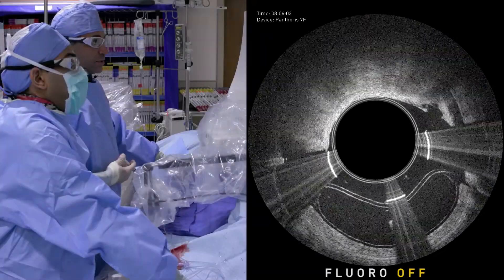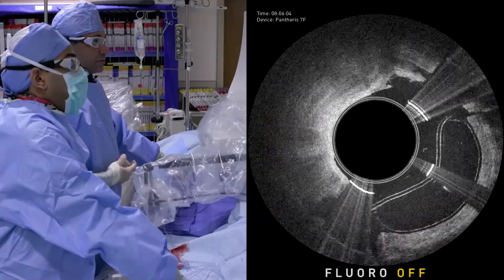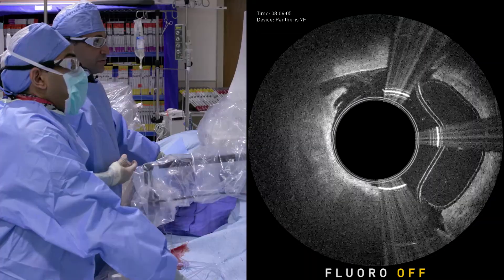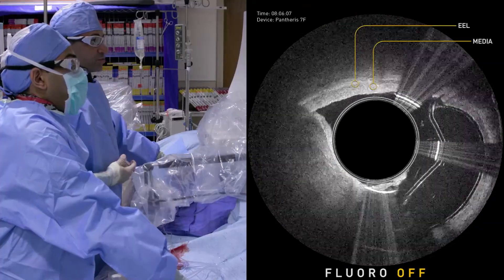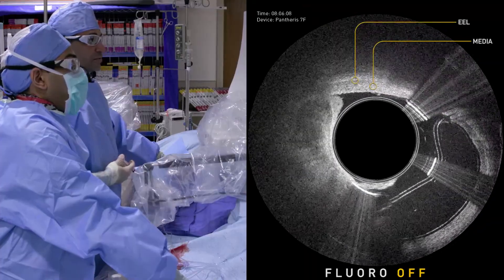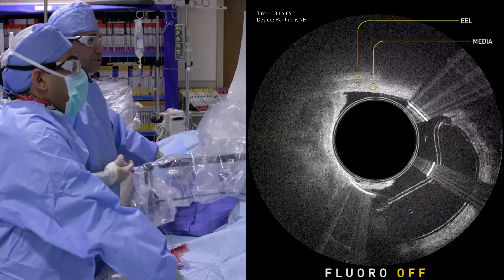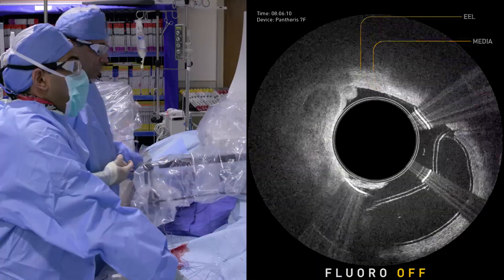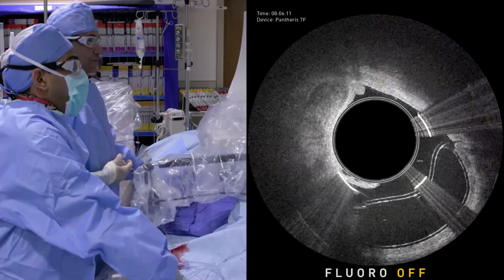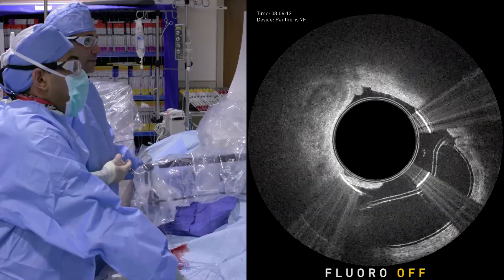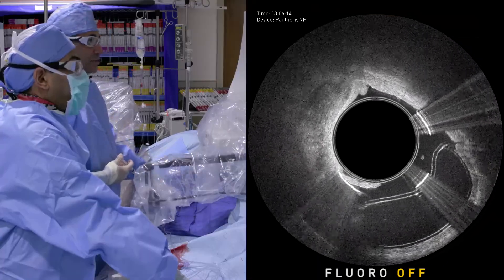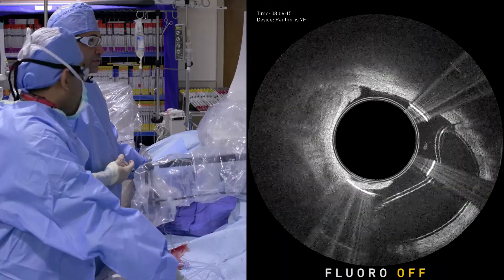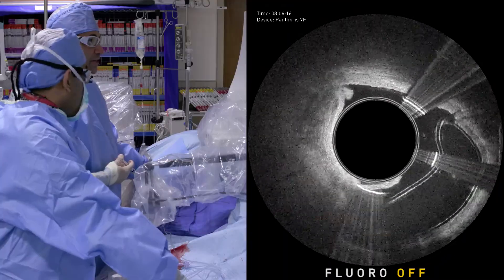I'm going to inflate the balloon and I'm going to slowly advance. And here at 12 o'clock, you see media adventitia. But we're away from that, and I can make sure that we don't get into that area.